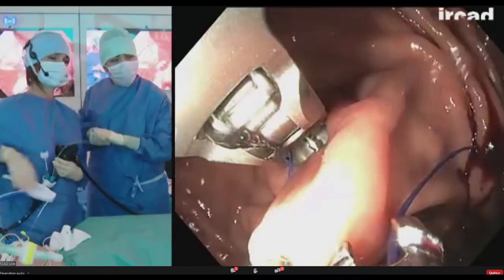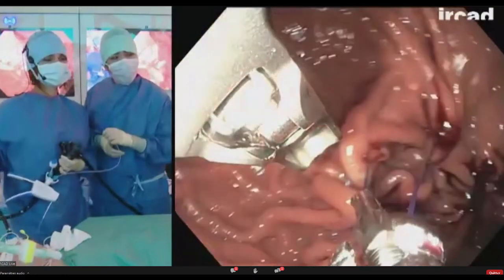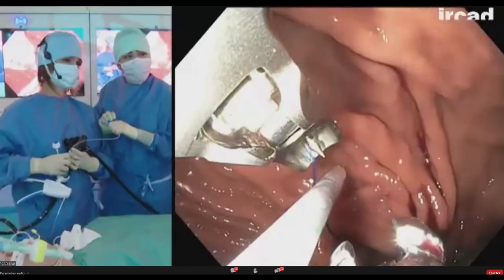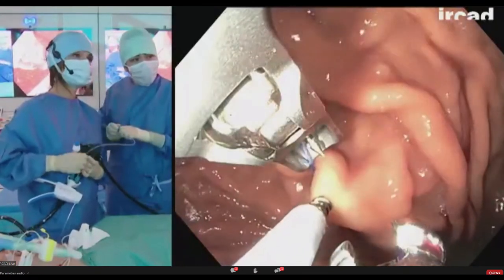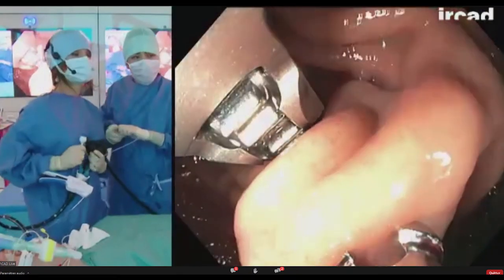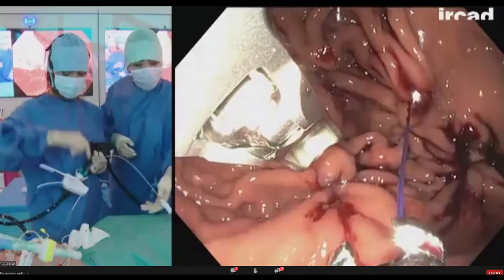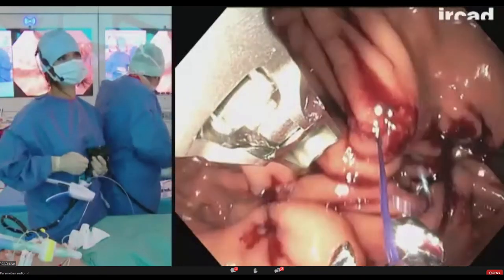We also have questions here for our friend Tarek Saleh from UAE, asking if we reinforce the first suture, and for sure we don't, not Silvana. Reinforcing is something that I'll let you discuss if you want. To reinforce the sutures? Yeah, the first one or any other suture. Yeah, no, it really depends on the tissue. So here I finish. I place all my stitches, and at the end of the procedure, I see if I have to reinforce.